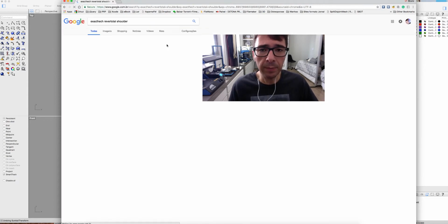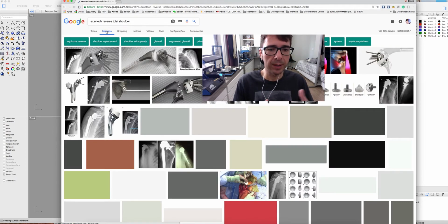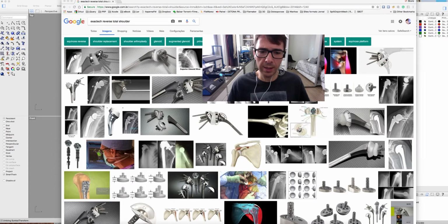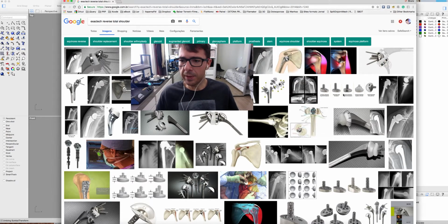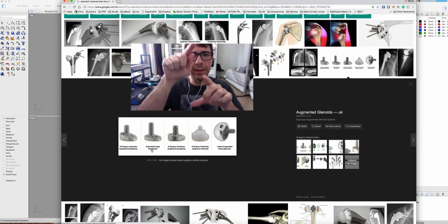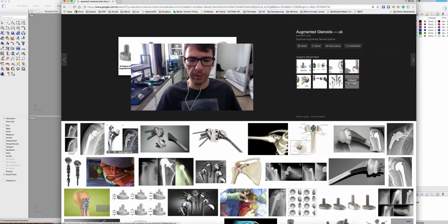This is the Exactech implant, and we are going to show how we can draw and design this kind of implant. This implant is a little bit different from others. As you can see here, the central pin is not in the center of the glenosphere, of the base plate, and so the offset is different, and the shape is not actually a cylinder, it's oval. But it's very easy to do as well. We will have no problems.